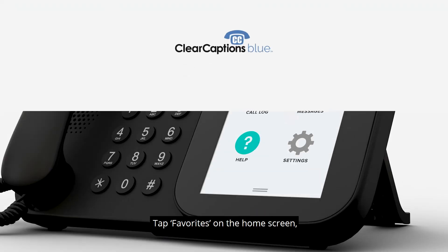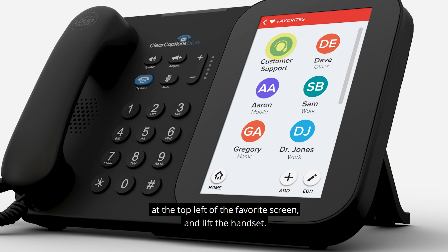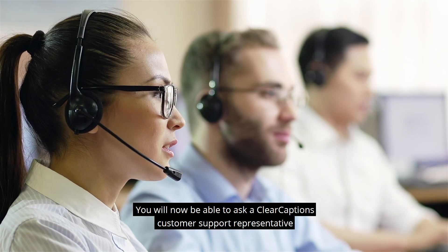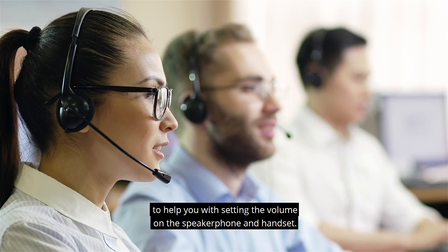Tap Favorites on the home screen. Tap the Customer Support button located at the top left of the Favorites screen and lift the handset. You can also find the Clear Captions support number on the inside of your handset. You will then be able to ask a Clear Captions customer support representative to help you with setting the volume on the speakerphone and handset.